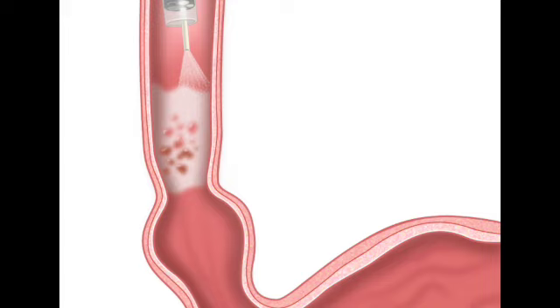Got it. And the geography of how they apply it is crucial, especially when we talk about a condition called Barrett's esophagus. Okay, how do they do it? The doctor feeds this spray catheter right through the endoscope. The camera tube they already have down the patient's throat. Right. The camera's already in there. Yep. They guide the catheter all the way down to the distal end of the esophagus. So meaning the furthest point down, like the bottom. Specifically, close to the gastroesophageal junction. Okay. That is the exact anatomical border where the esophagus meets the stomach.